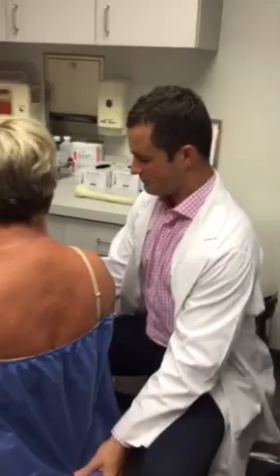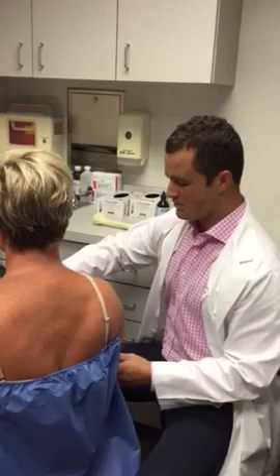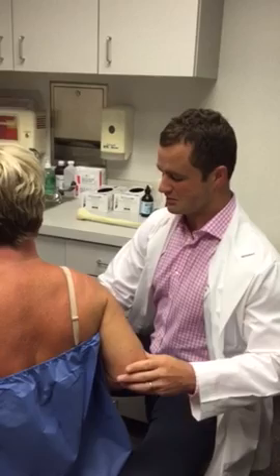At the beginning of the exam, I have the patient sit facing the screen, bend their elbow to 90 degrees, arm at about neutral rotation, and then rotate out. Since we're in Texas, we say we're going to have you grab your gun — and that's the modified CRASS position to look at the supraspinatus.